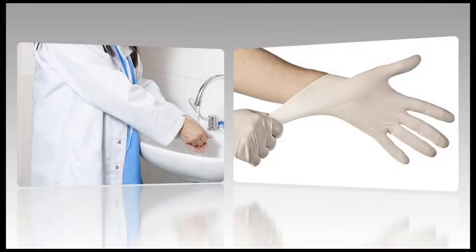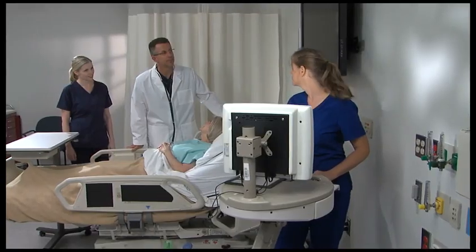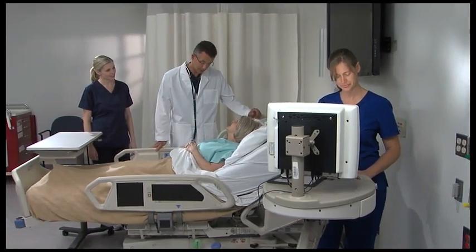After thoroughly washing hands, don clean gloves in preparation for pre-cleansing of the perineal area. Ensure adequate lighting. Arrange for extra nursing personnel to assist as necessary. The female patient is best catheterized in the dorsal recumbent position. An alternate position for the female patient is side-lying Sims. The knees must be adequately separated to obtain a clear view of the periurethral area.